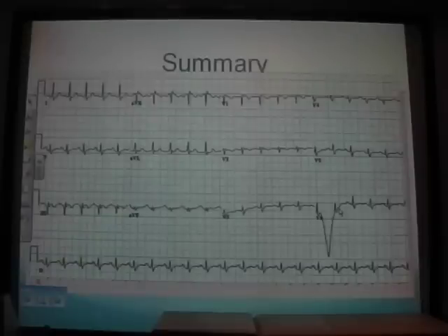Could you present the ECG, please, in full? Fine. Well, you found that it's S1Q3T3. So she has got signs of PE on her ECG now, so she has got PE.